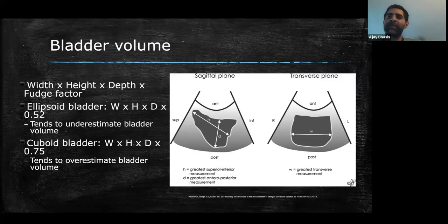And if you're thinking about what's going on with this image, this is exactly when your nurses have a bladder scanner tool. This is what the bladder scanner automated tool is doing, measuring to get you that estimated bladder volume.